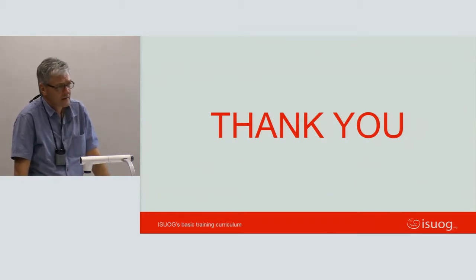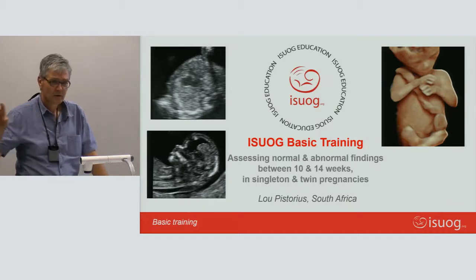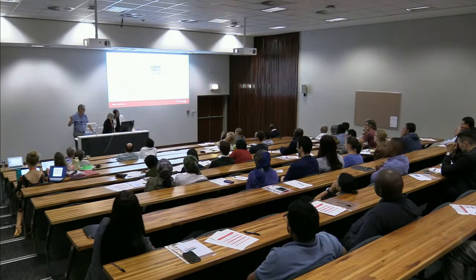But it is always dangerous to assume that when you don't see a normal picture as you expect to see it, it is your fault and not the baby's fault. And that's the one thing that grows with experience, that you start knowing what you normally should see.